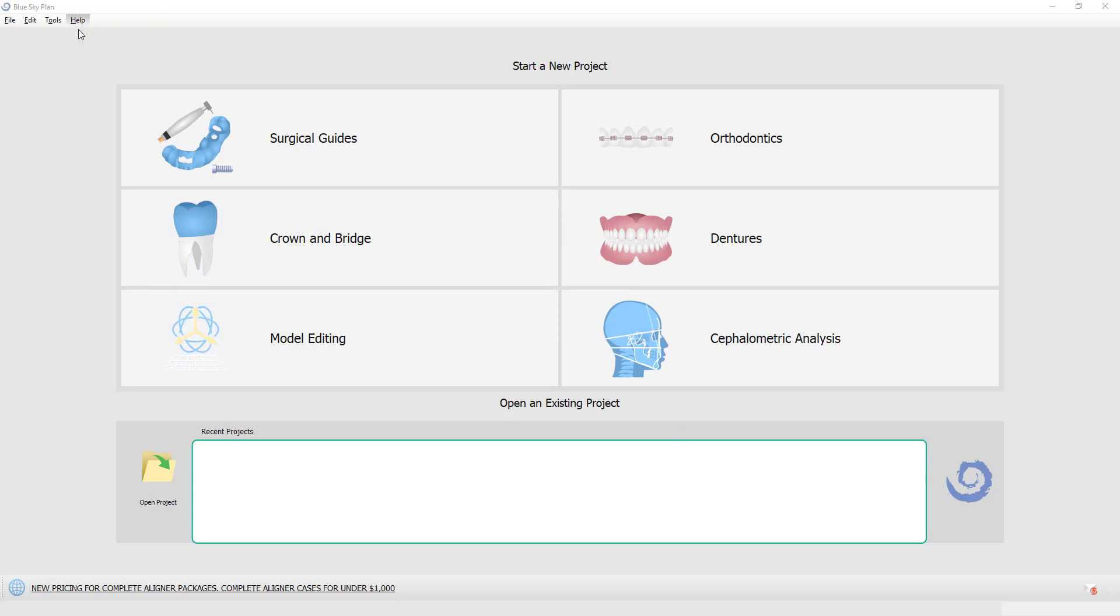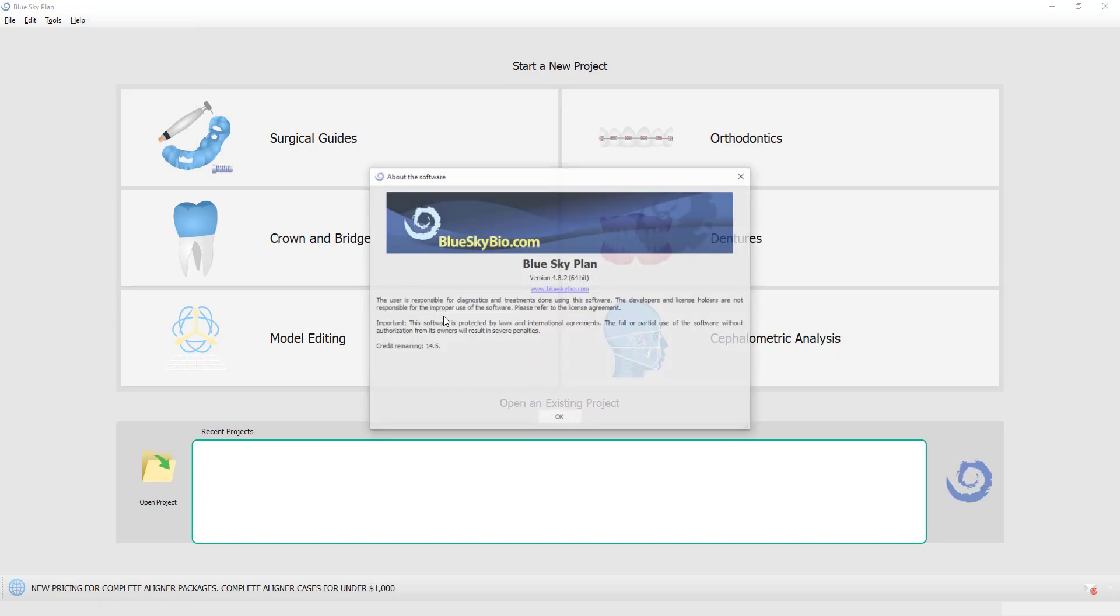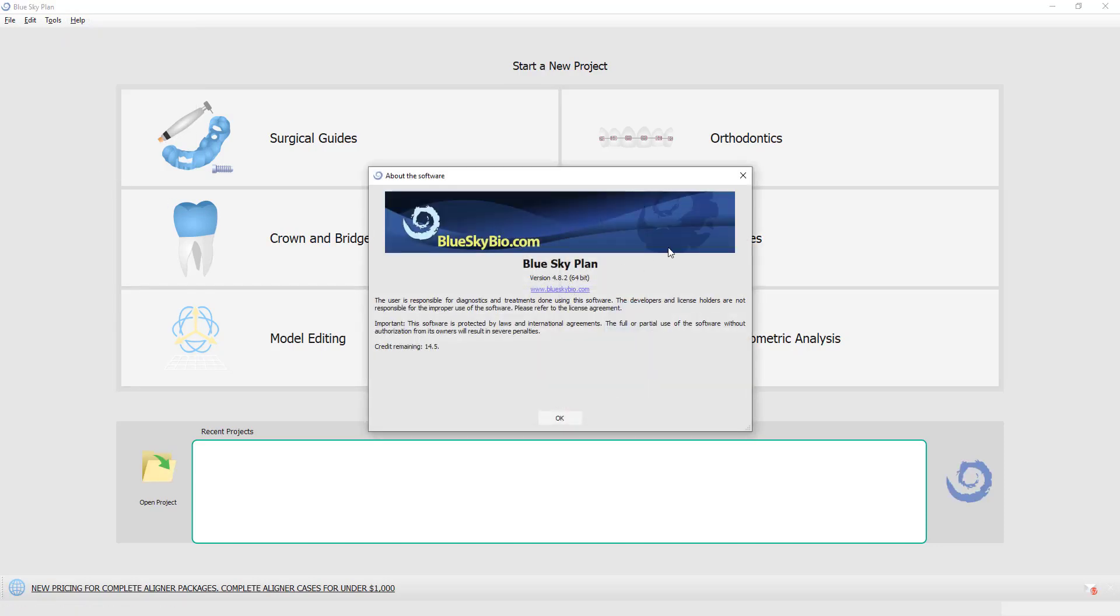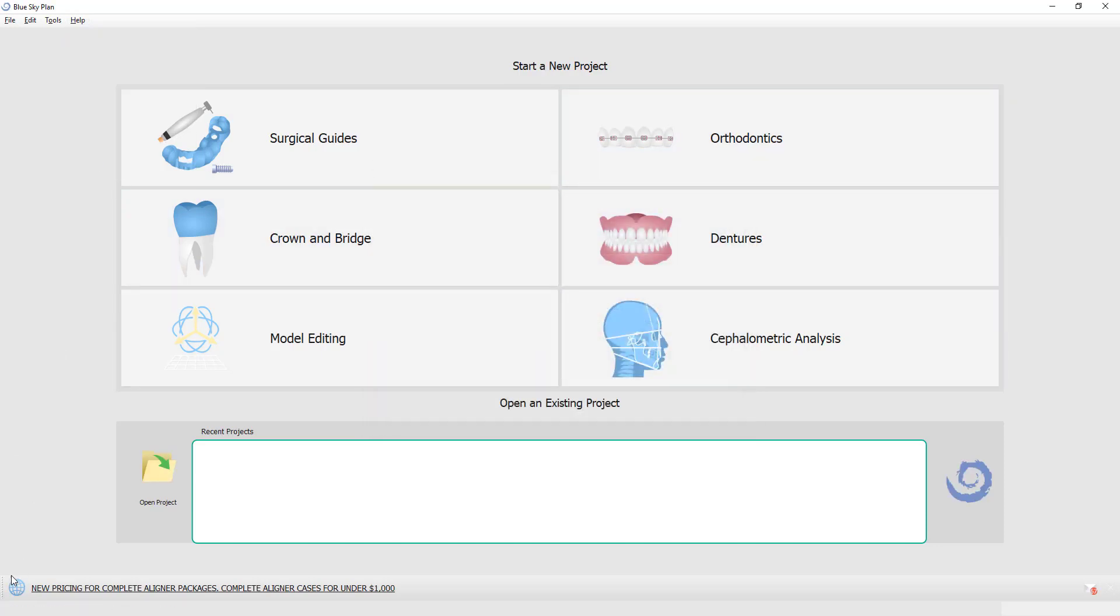First of all, I'm using version 4.82 of the BlueSky Plan software. If you don't have it, upgrade from the BlueSky Bio website.